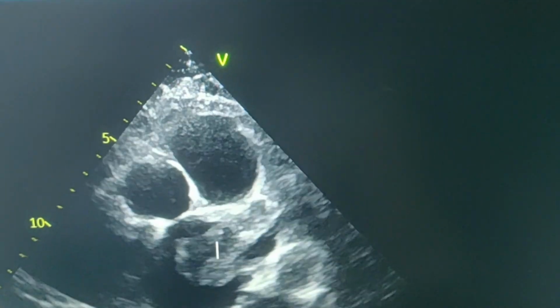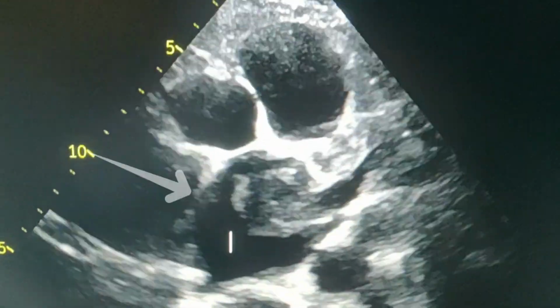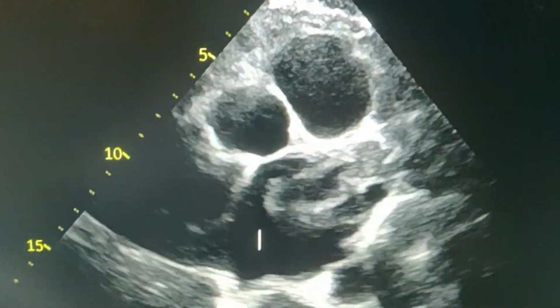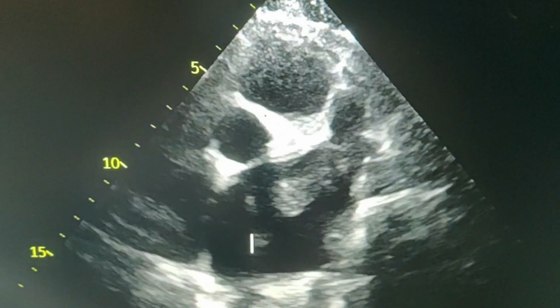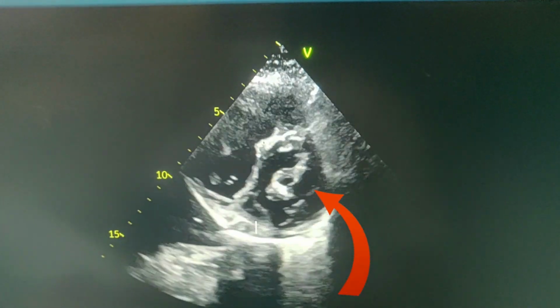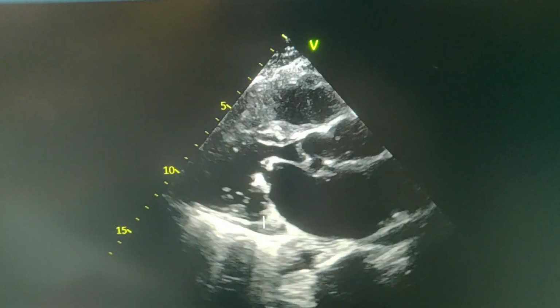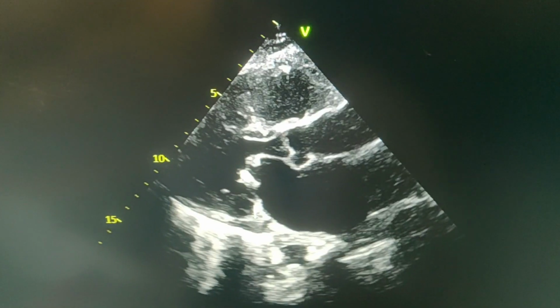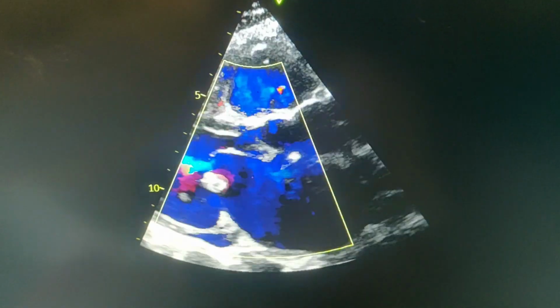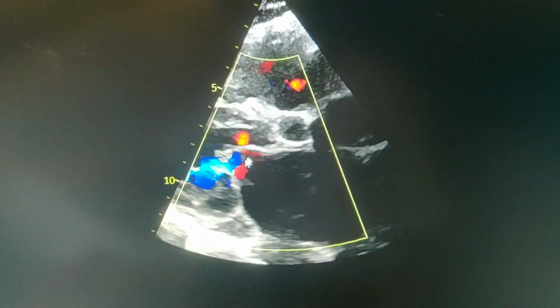This patient had probably normal sinus rhythm, and what you can see, the LA is dilated, the intra-atrial septum is free, so probably could not be a myxoma. The pulmonary vein orifices look okay, but in short axis, the mitral valve orifice is stenotic. There is calcification of the tips of the AML and PML. The left atrium is very much dilated, and on color Doppler, we established a diagnosis of severe mitral stenosis. The aortic valve seemed normal.